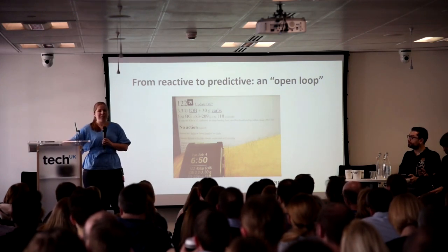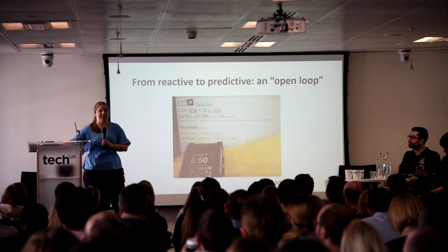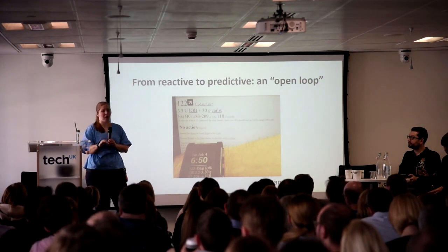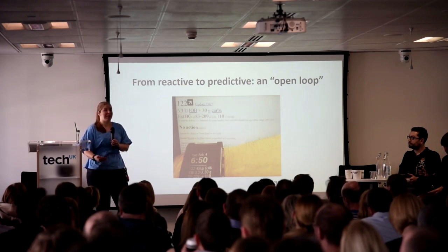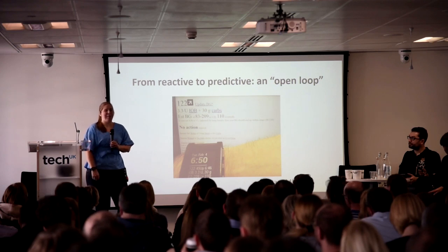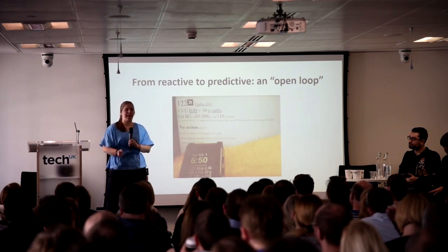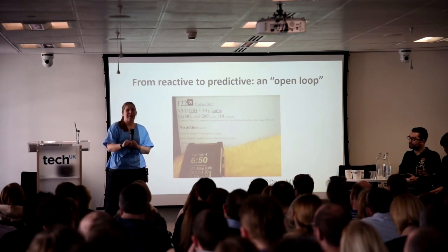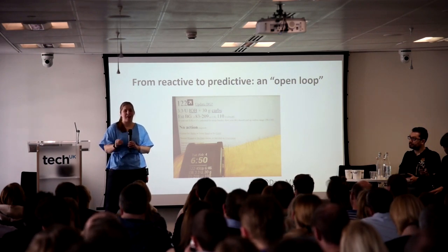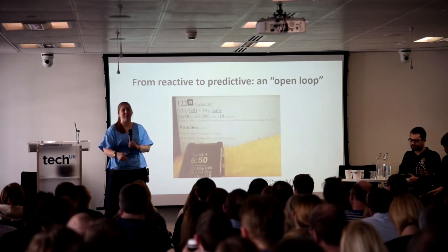But the other thing we did with the system is not just CGM data, but we added buttons so that I could snooze the alarm so it wouldn't wake everybody else up. However, aside from being the world's best trained guinea pig, every time I did something, I pressed the button. But we added specific buttons so I could tell it, am I taking insulin? Am I eating carbs? What is going on? And because we had that data, we realized we could map all of that. Real-time food data, real-time insulin data, real-time CGM data.